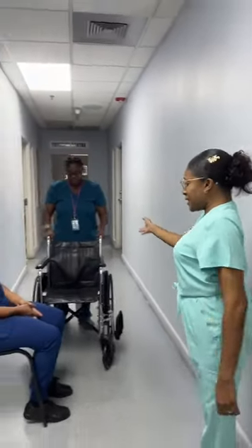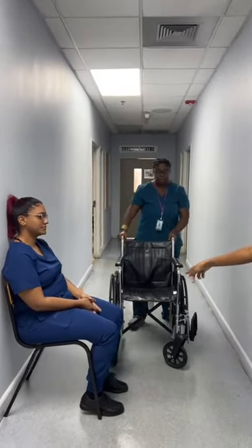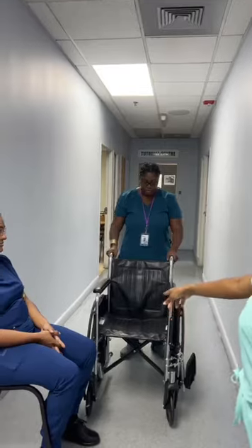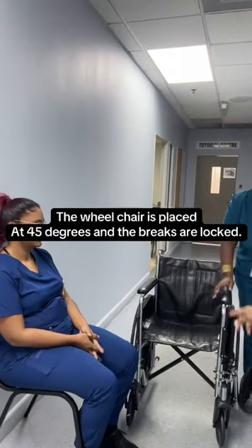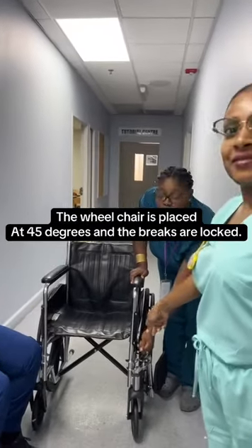As you can see, our assistant is positioning the wheelchair at a 45-degree angle, close enough to the client to ensure that she can go into it. She has to ensure that the brakes are on.